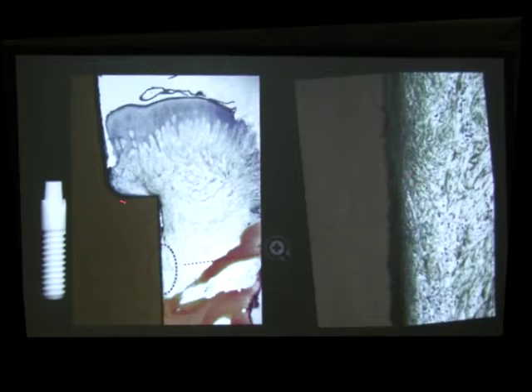These implants, even if they are completely straight without a shoulder, are not able to be probed more than 2 millimeters. And sometimes natural teeth with a very healthy periodontium probe deeper than these implants. And we think it's because, first of all, it's one piece, so there are no subgingival connections. This is the most important factor. And the second factor is that it's an acid-etched surface where the fibers can get good adherence.